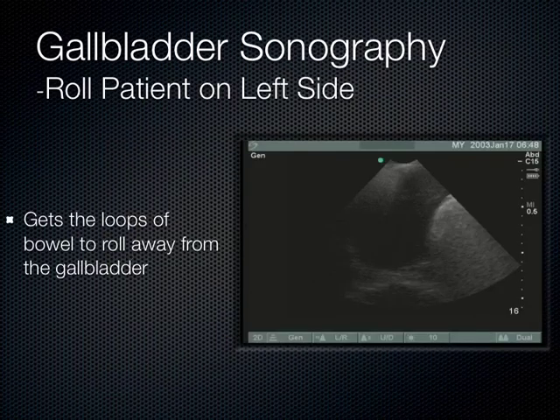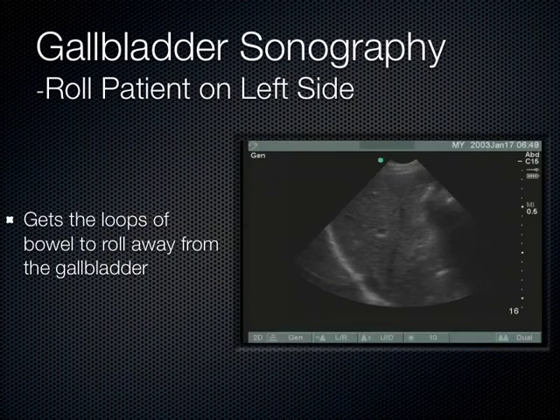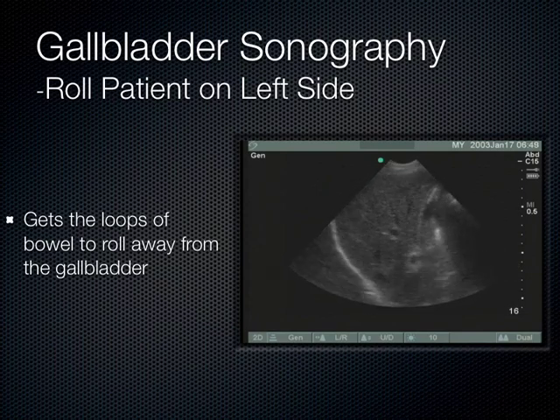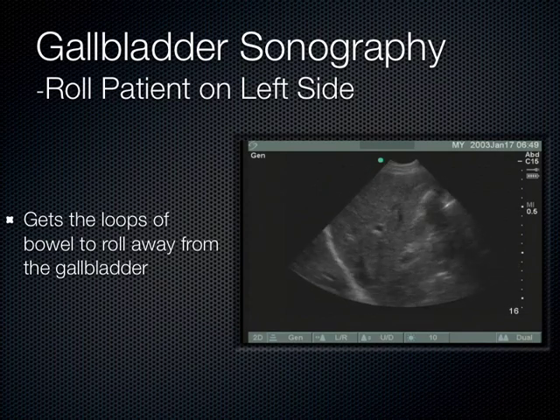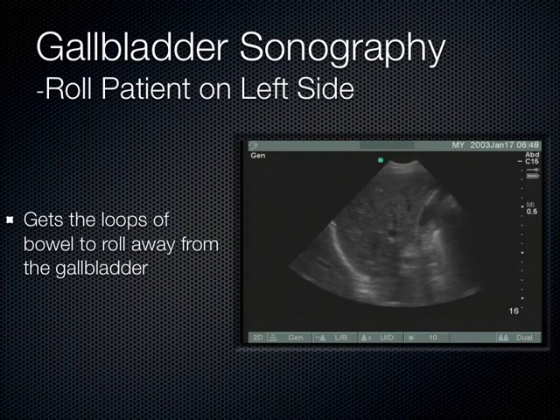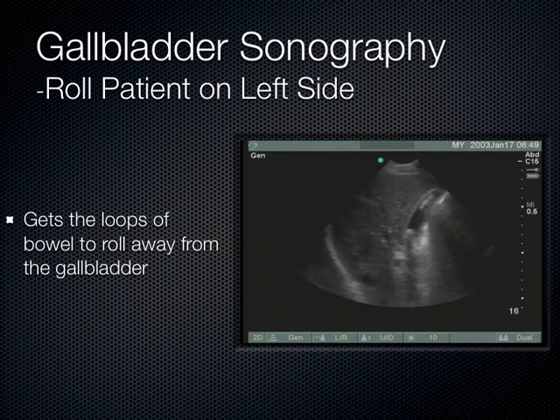Now, anybody know what organ lies just posterior to the gallbladder? So in other words, if you were to take, there's a plate on Netter that I should have up here. Yeah, the kidney is posterior to it, but there's another organ that gets in the way. The kidney's our friend. There's an enemy that gets in the way there, actually.